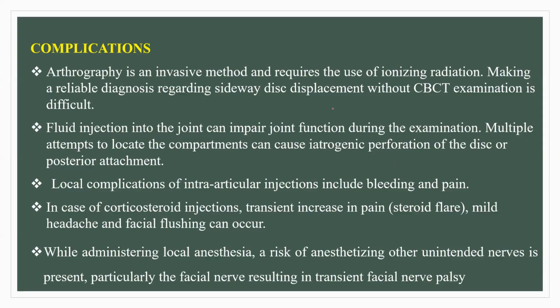It is an invasive method and requires the use of ionizing radiation. Making a reliable diagnosis regarding sideways disc displacement without CBCT examination is difficult. We have already said CBCT can be the most reliable method, so that is not being used here. Then, fluid injection into the joint can impair the joint function during examination. Multiple attempts to locate the compartments can cause iatrogenic perforation of the disc or the posterior attachment.